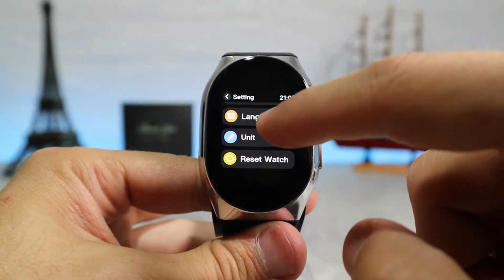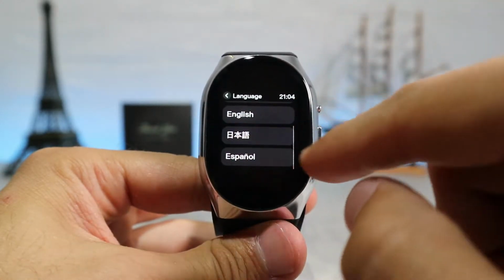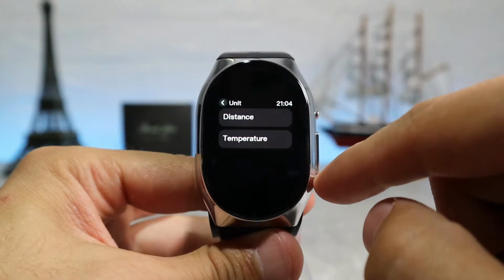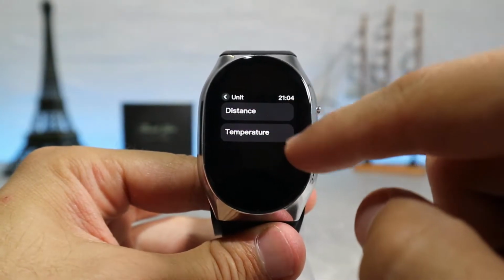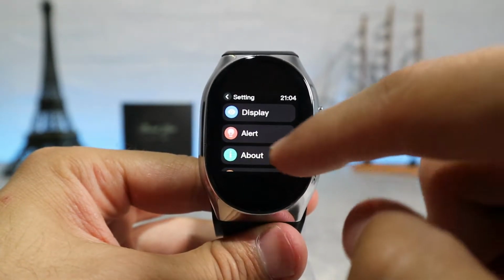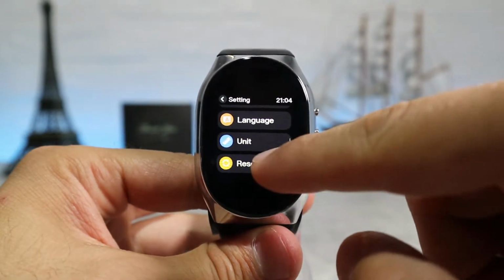The watch supports 5 languages: simplified Chinese, traditional Chinese, English, Japanese, and Spanish. The unit function allows you to select whether the distances are displayed in kilometers or miles and the temperature in Celsius or Fahrenheit. Reset will delete all data and restore the watch to its factory settings.